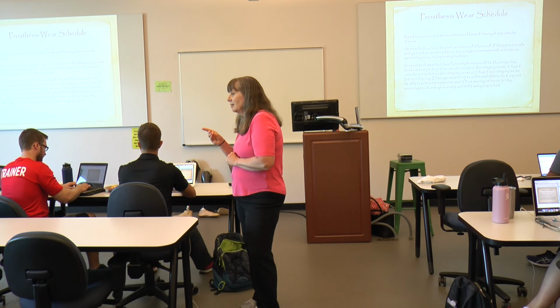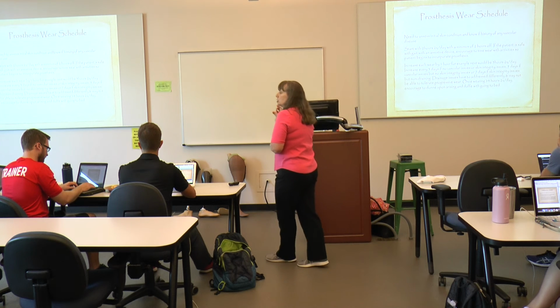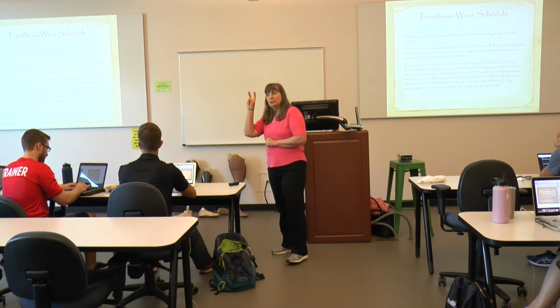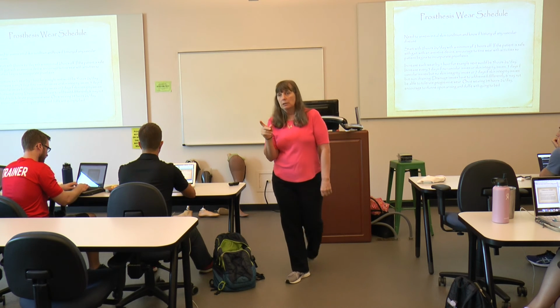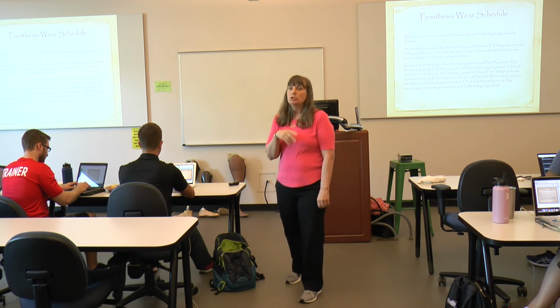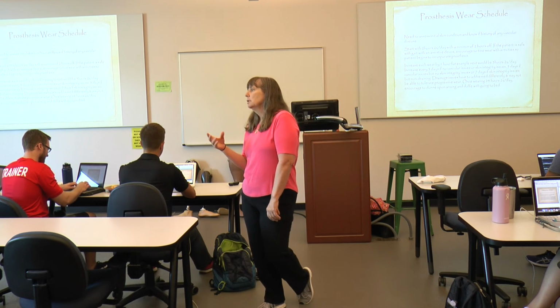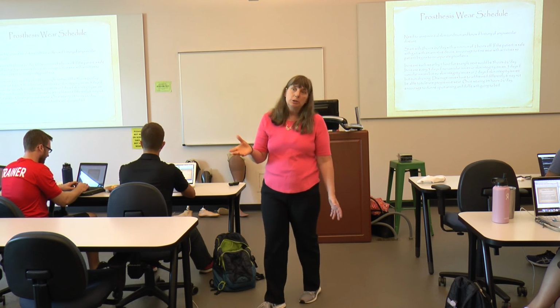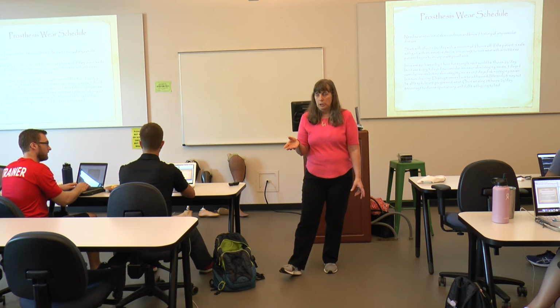Are we good? Okay. What I do at that point, there are 2 questions I ask when the time is ready to consider going up. One, what does their skin still look like? Do I have some skin issues starting? Something going on? Have they gotten a blister? Am I getting a heat rash? Is the skin still looking okay? Okay? That's the first question.